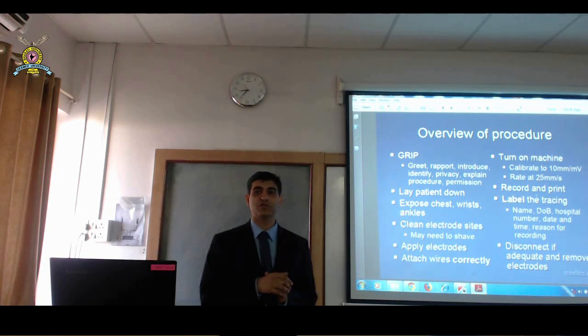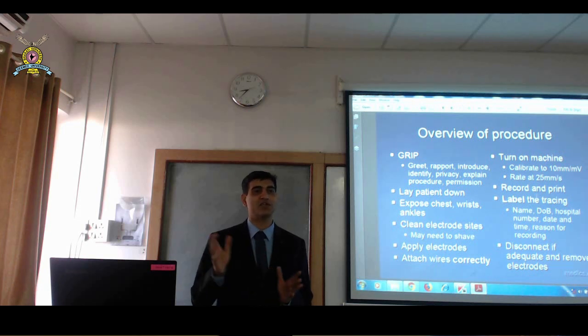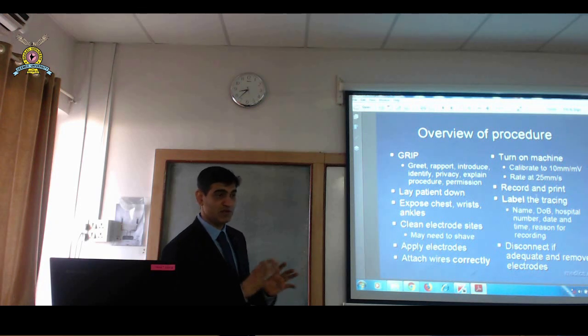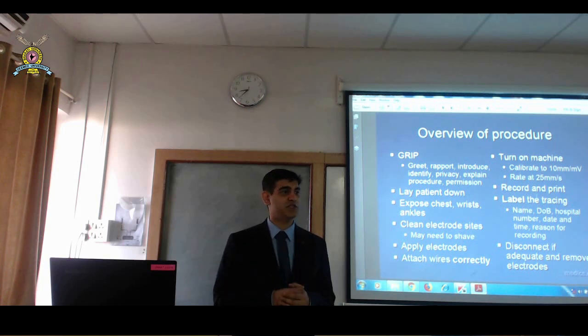That's very important. A patient whose ECG is done for chest pain, that has meaning. If a patient's ECG is done for collapse, that has a different meaning. If somebody has palpitations, that has a different meaning. The person who reads it will understand why the ECG has been done. Sometimes you will do a routine ECG. The patient says, I have not had an ECG for the last 6 months, I want one, and that is a routine ECG. So label the tracing, record everything there, disconnect if adequate, and remove the electrodes. Once the recording is done, your nurse should show it to you, or you should see it yourself. See if you are happy with the ECG tracing. If you are not happy, repeat the ECG.